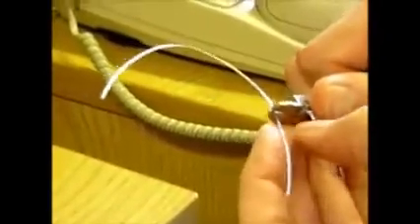Now, the other sort of bend you might be asked to put in is intrusion or extrusion. And so if we put one in the middle here, between these two, always make sure the torque's the right way around, so that you know that that's where the roots are. I'll put an intrusion bend in because it'll keep the wire flat for the time being. But they're very simple in that you just go up and down and then down and then up. So you've got a little step, and you probably cannot do more than about half to 3/4 of a millimetre, so that it goes up.